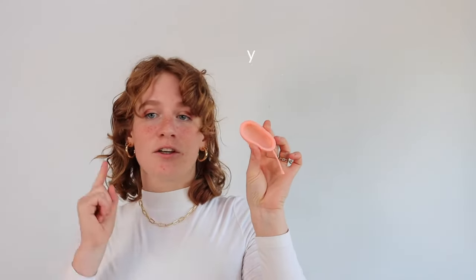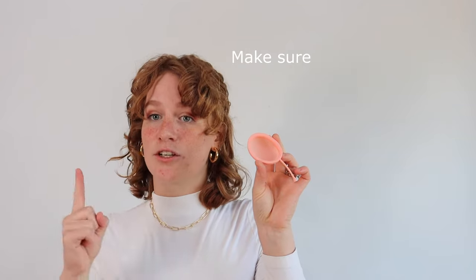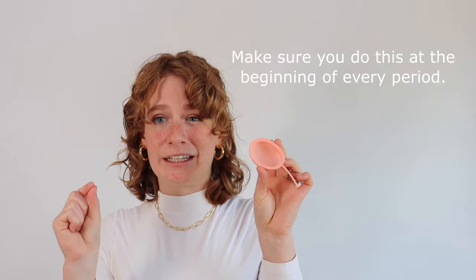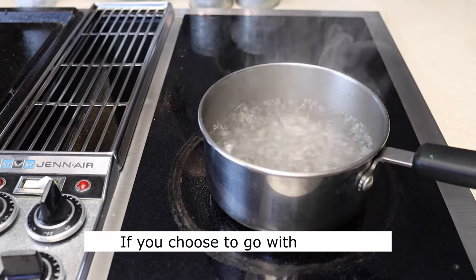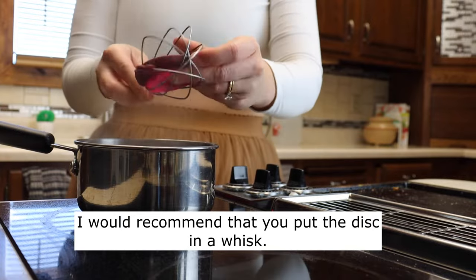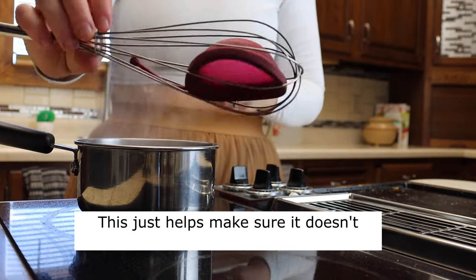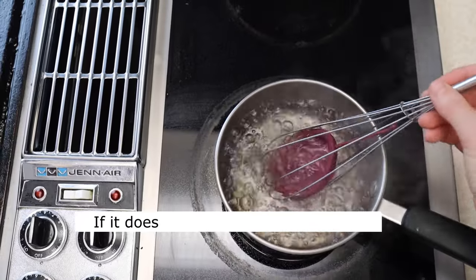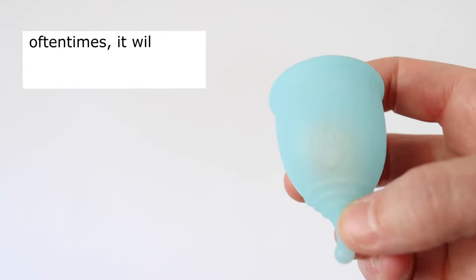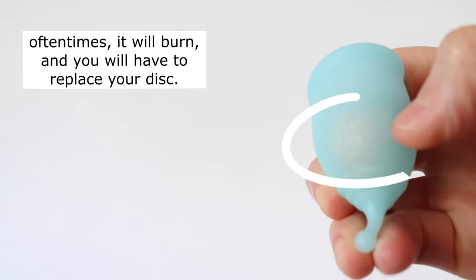When you first get your menstrual disc you're going to want to make sure that you sterilize this. Make sure that you do this at the beginning of every period. Now there are three ways to sterilize: boiling, steaming, and spray. If you choose to go with boiling I would recommend putting the disc in a whisk. This just helps to make sure that it doesn't touch the edges of the pot. If it does touch the edges of the pot oftentimes it will burn and you'll have to replace your disc.